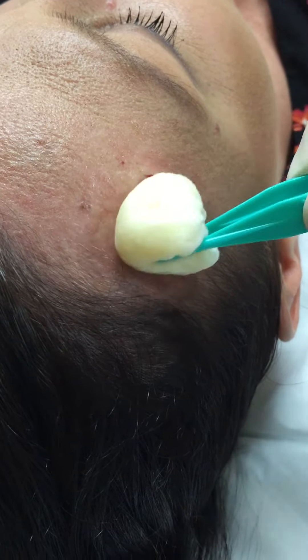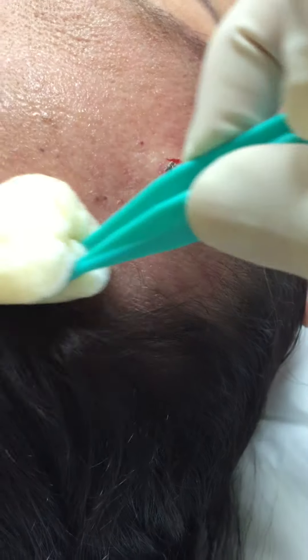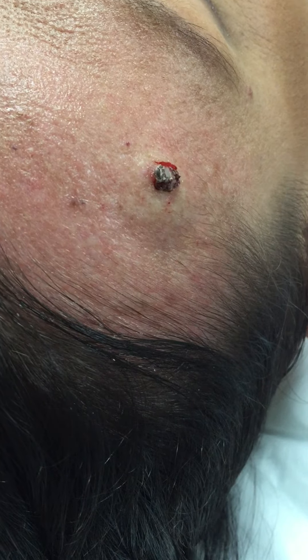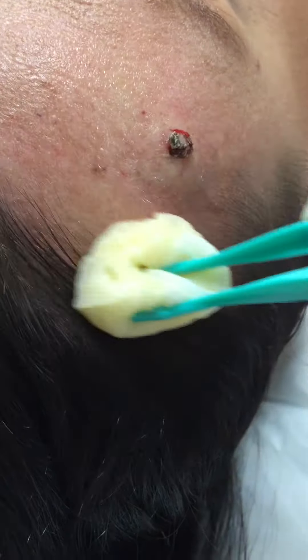Just cleaning the skin now. This is a separate keratosis. Second clean. I'm going to put a little drape over the forehead now.